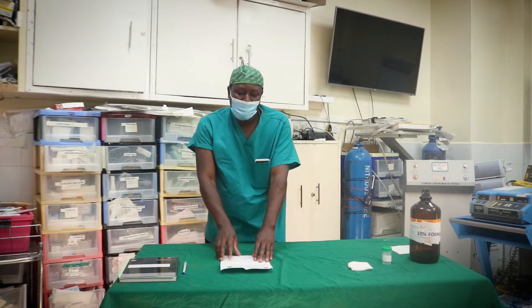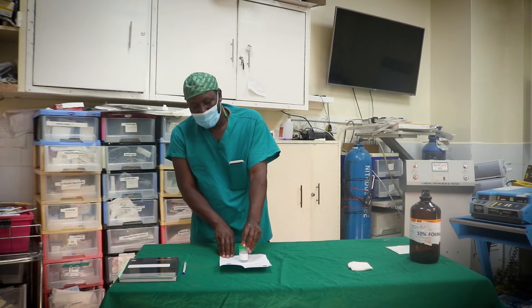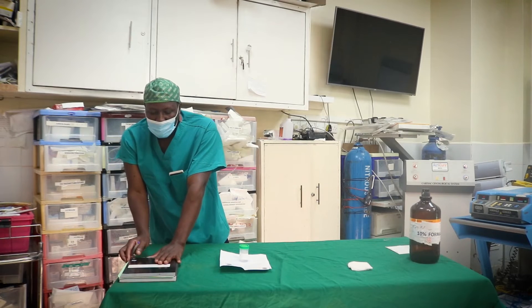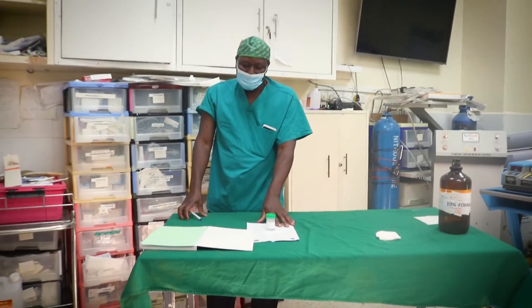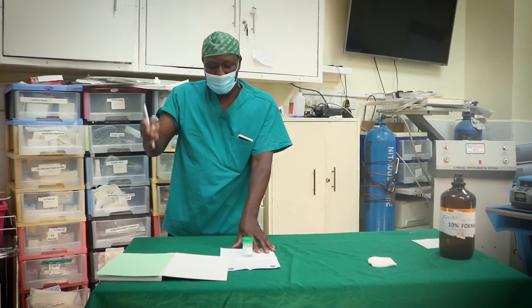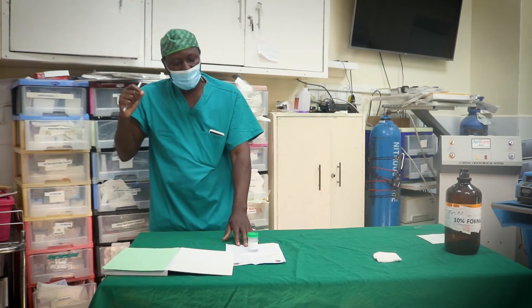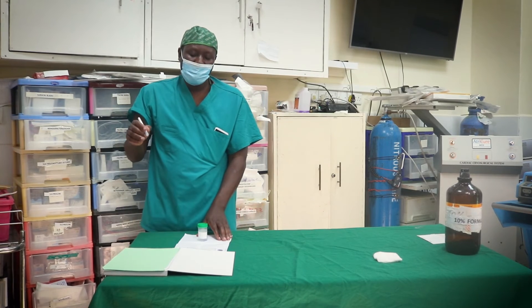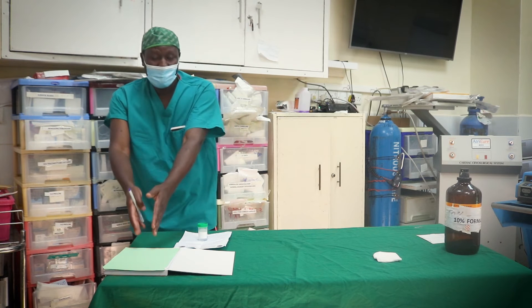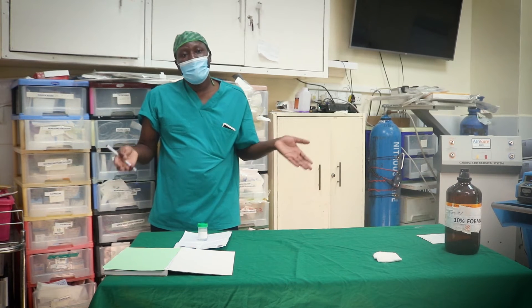After signing the form, the circulating nurse will take the form together with the biopsy — already immersed in formalin — and register it in the biopsy register. In the biopsy register, the circulating nurse ensures the biopsy is registered for tracking purposes, recording the patient's name, doctor, hospital number, and specimen. A personnel from the histology department will come to pick the specimen and must also sign the register to confirm collection, ensuring continuity of care.